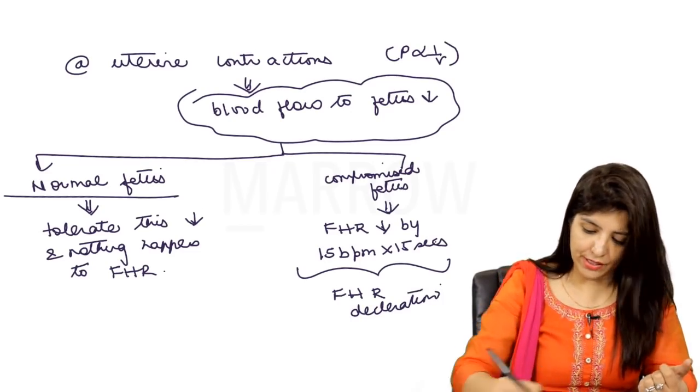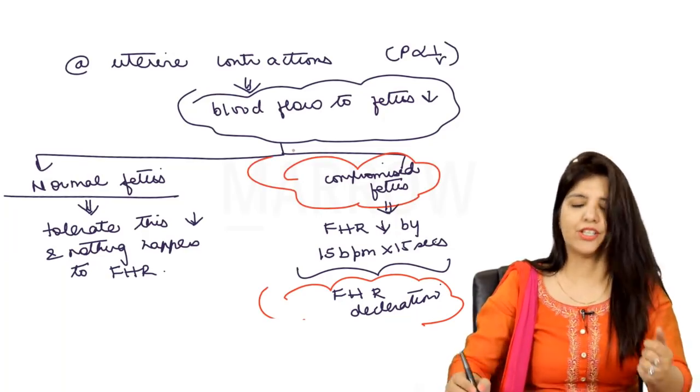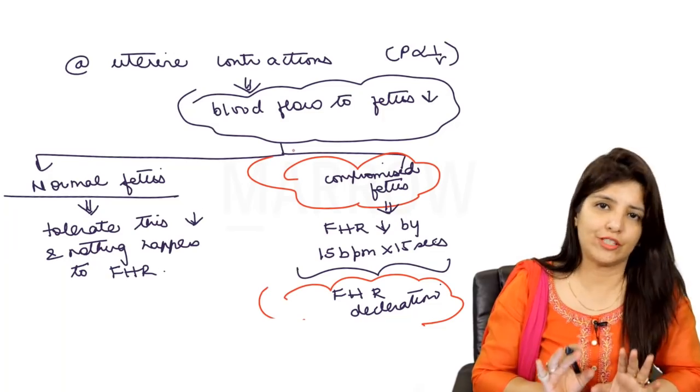Fetal heart rate deceleration is never normal, right? Fetal heart rate deceleration indicates that there is some problem with the fetus. Fetal heart rate acceleration always denotes a healthy fetus. Fetal heart rate deceleration denotes that there is some problem with the fetus, right?